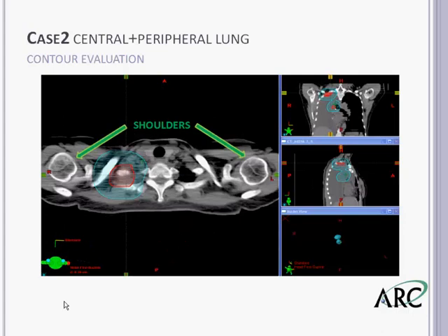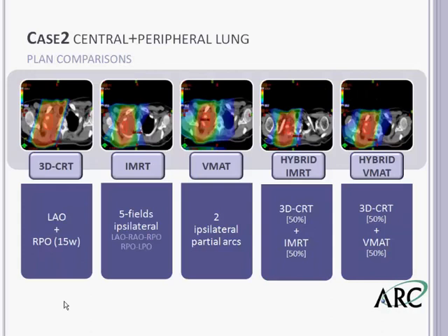Another issue was that this lesion extended so far superiorly that the shoulders became a concern. For this case, the 3D CRT plan was an LAO and RPO with wedges. We had a five-field ipsilateral IMRT plan completely off the shoulders, two ipsilateral partial arcs for VMAT, and finally our 3D CRT and IMRT hybrid and hybrid VMAT, again 50/50 weighting.